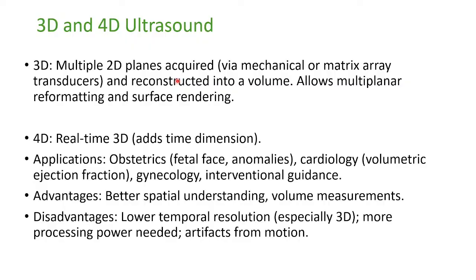The difference basically between a 3D and a 4D is that a 3D is a static image that you can acquire, whereas the 4D is now a video, or a motion. It shows a small image that is moving. I will show you the difference in the next slide.